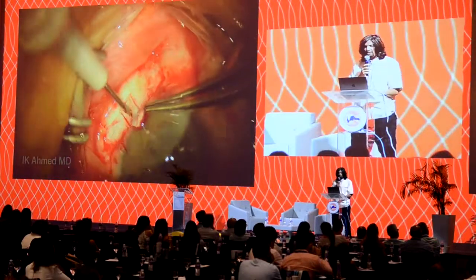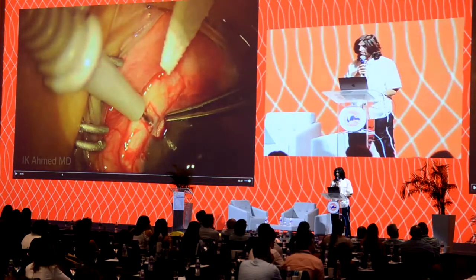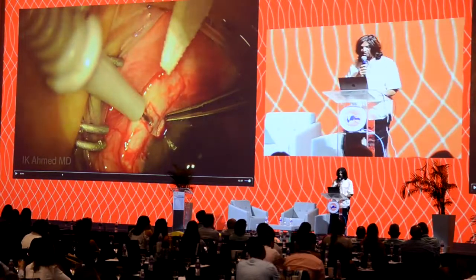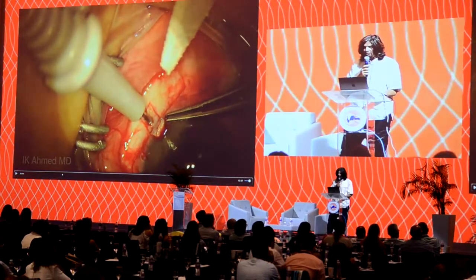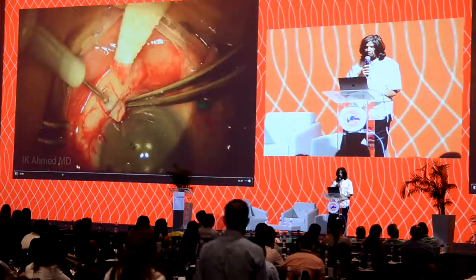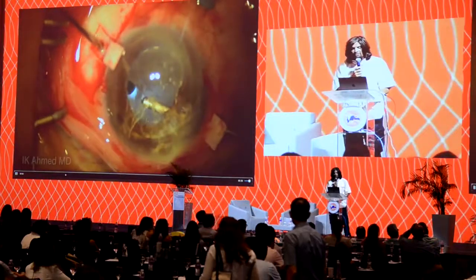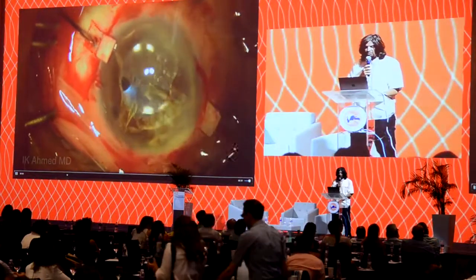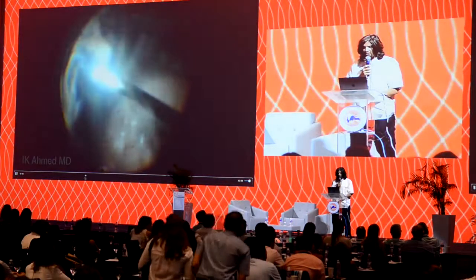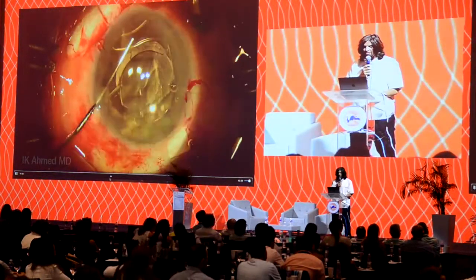We'll make our sclerotomy, making sure the sclerotomy, by the way, is not too anterior. Because if it's too anterior, it can result in pupil capture and chafing. So we want to make sure we identify not the limbus, but the blue zone, and go posterior to the blue zone, about 1.5 millimeters from the blue zone. We can then do some vitrectomy as needed to make sure we've cleared the anterior segment of any vitreous. And we'll fast forward that. It's important for these scleral-fixated lenses to do that.